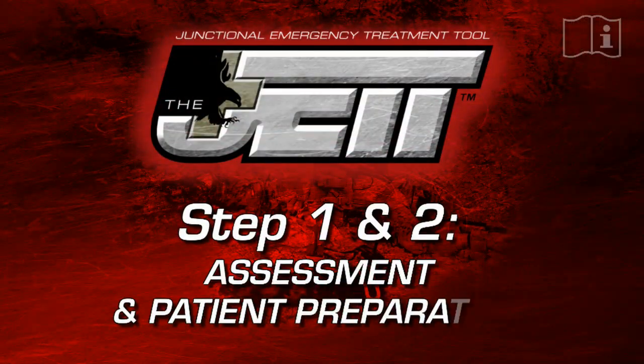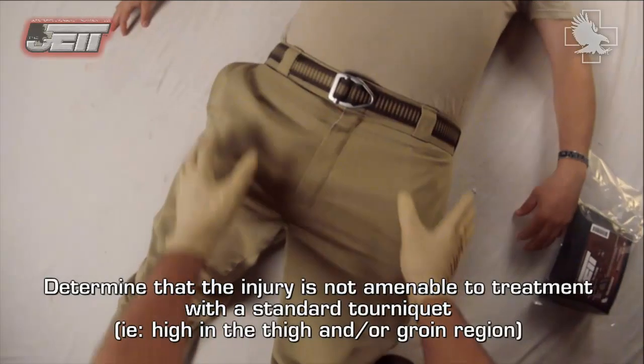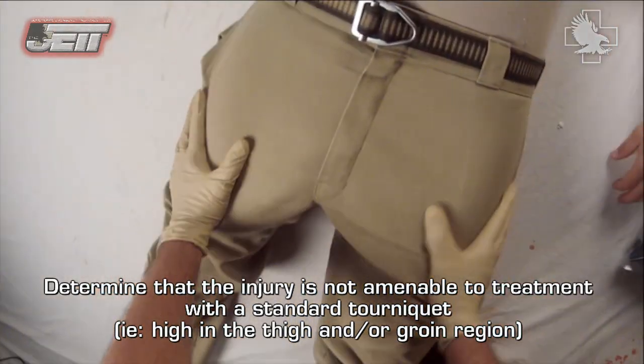Step one and two: assessment and patient preparation. Determine that the injury is not amenable to treatment with a standard tourniquet — for example, high in the thigh and/or groin region.